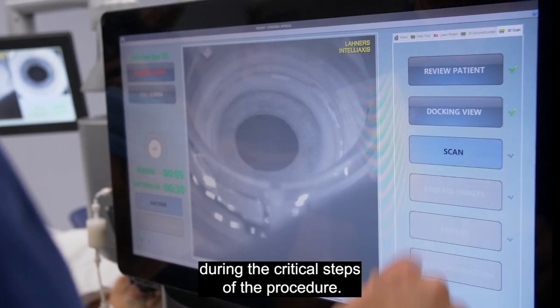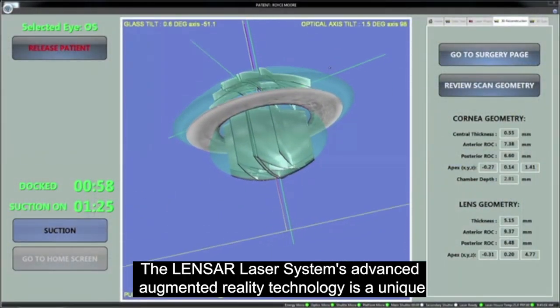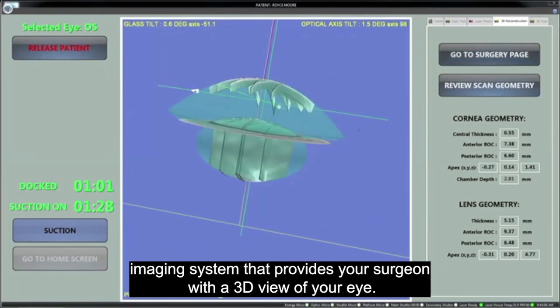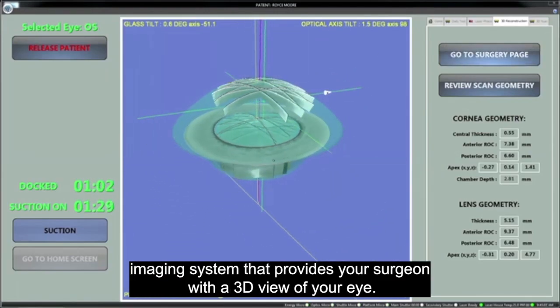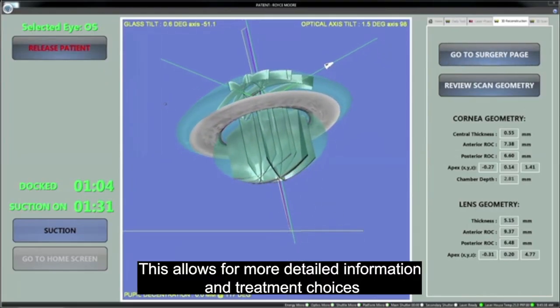So it is much safer, causes lesser inflammation, reduces the heat in the eye, and it's a cooler process, reduces the power required for removing the cataract, also reduces the cylindrical number or the astigmatism.